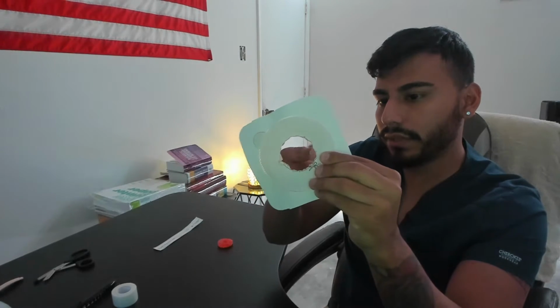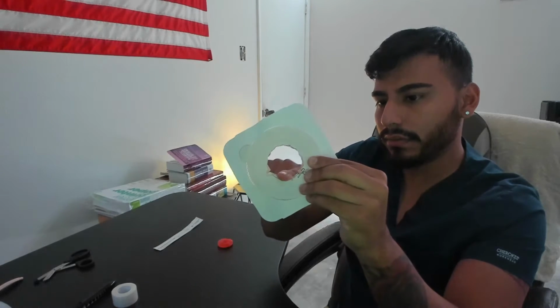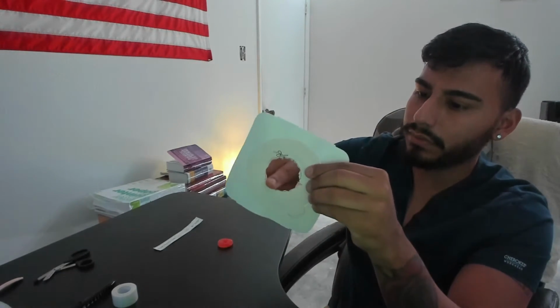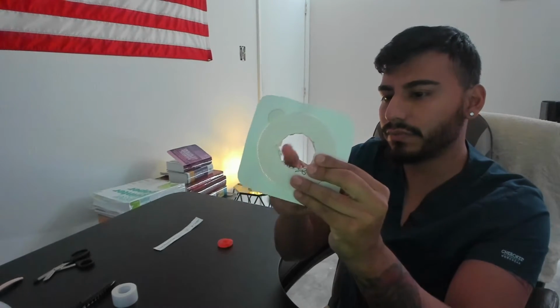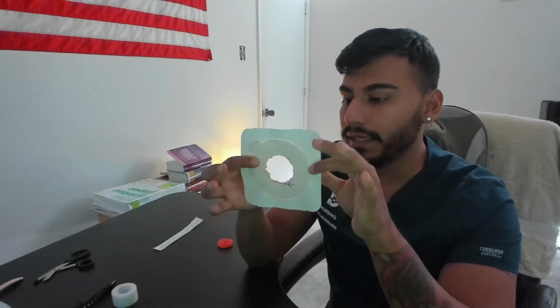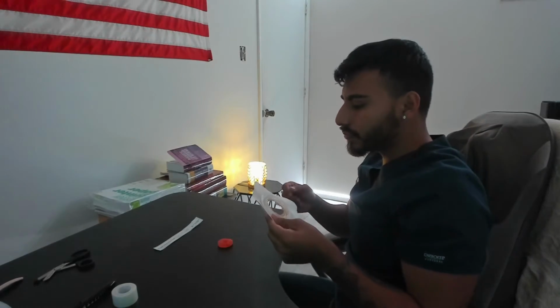Smooth it out. Use my body heat to smooth it out. Fortunately, it's probably going to take all day to smooth it out, but I would just verbalize that I would not place this if it had jagged edges. I would do it until it's completely smoothed out. I'm at 17 minutes. Okay. So I would smooth it out.